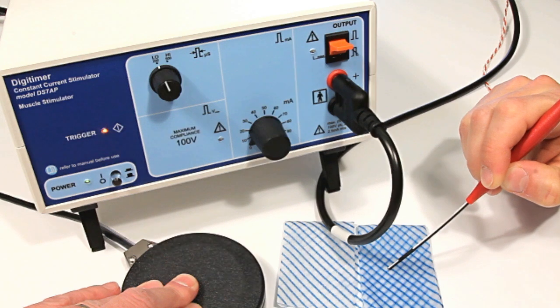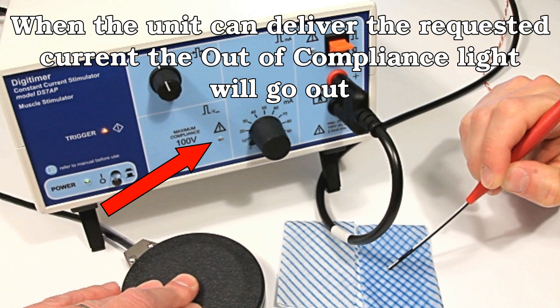When the probe tips are placed on a lower resistance saline moistened towel, this warning LED is extinguished indicating that current is now passing successfully.